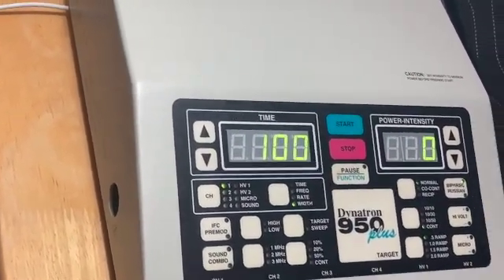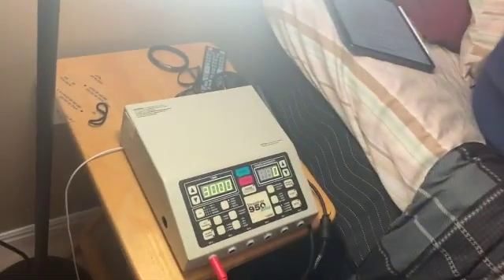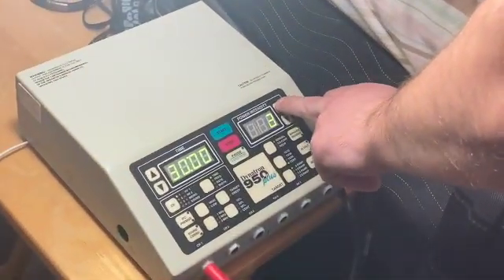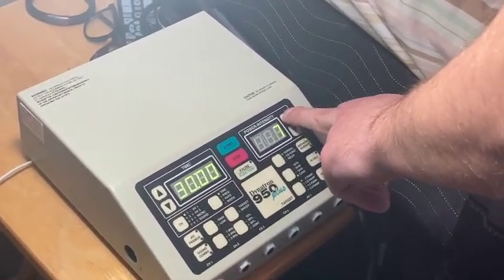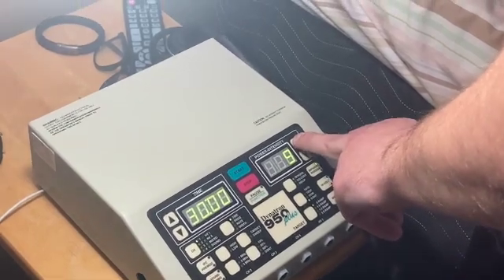So now for the intensity, I'm going to take that up slowly until Kevin reports having a nice tingling sensation, and it shouldn't be painful, and we don't want to see any muscle contraction. So if you start feeling like your muscles are going, just let me know and we'll back it off. Okay. All right. We want to have a nice kind of strong tingle. It should help. All right, so we'll take you up nice and at a good pace here. Just let me know when you start to feel a little tingle. Should be close.